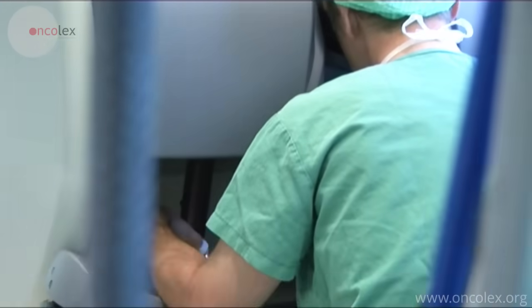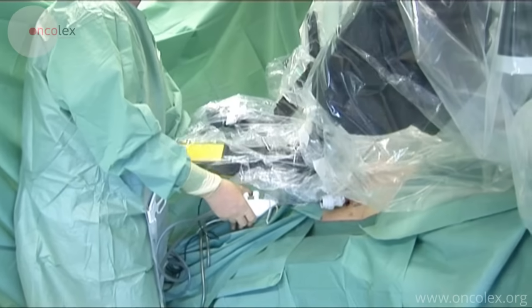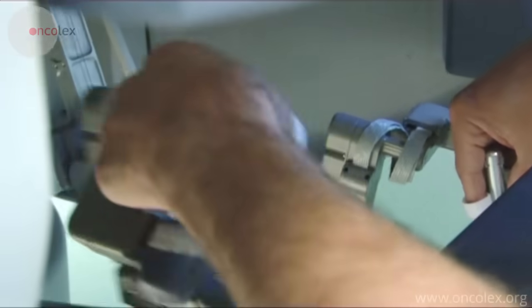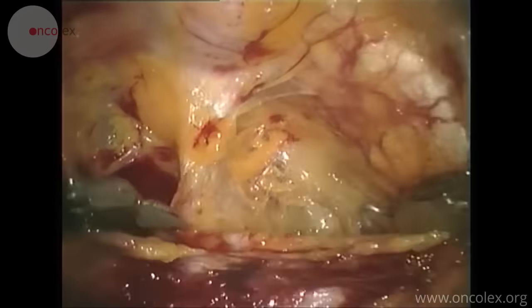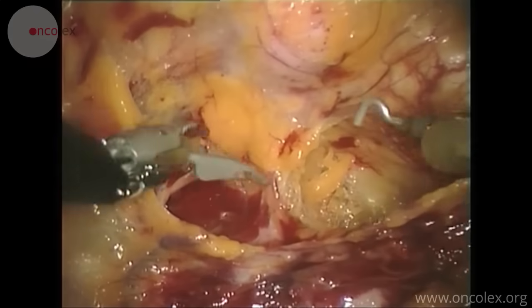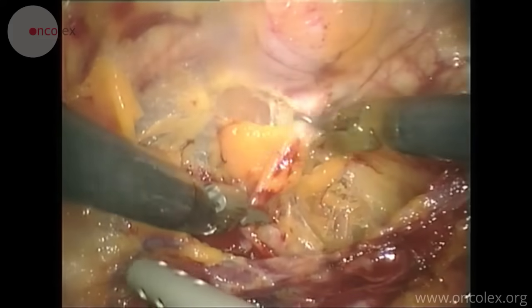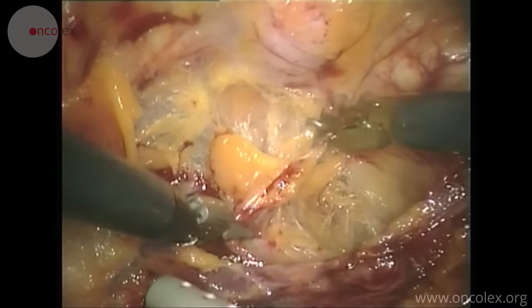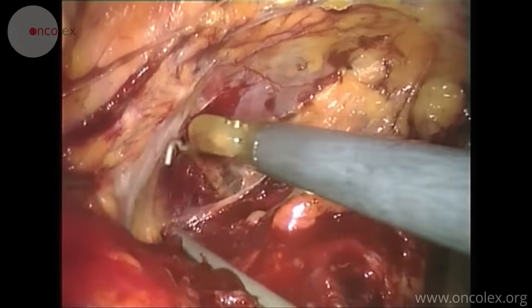The surgeon sits at the console while the assistant stands on the right side of the patient. The bladder has been pushed down and the surgeon is getting closer to the prostate. Some fat is dissected and removed to gain a better view of the anterior prostate and the transition to the neck of the bladder.